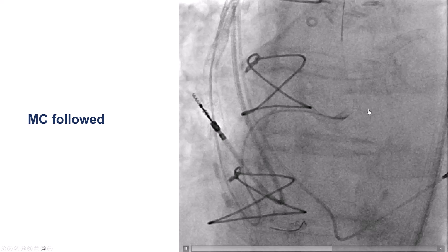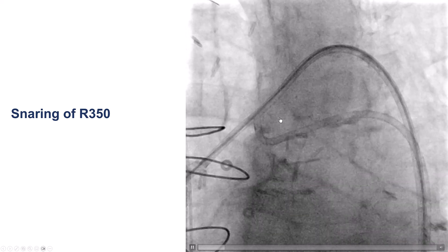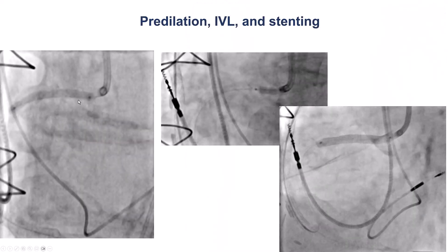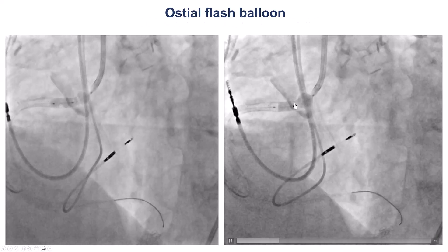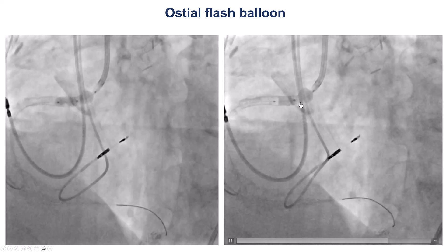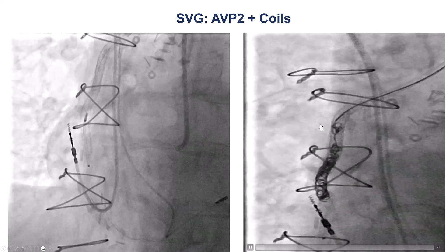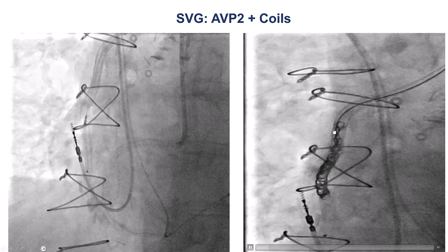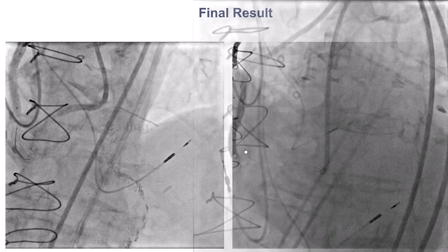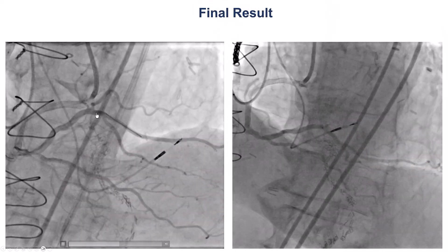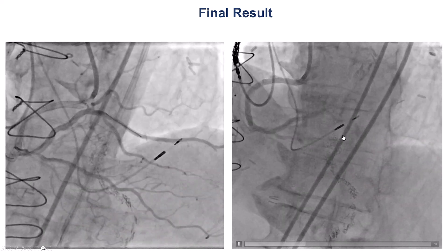We advanced the retrograde Corsair into the aorta, then snared an R350 guide wire. After that, we predilated and stented, using an ostial flash balloon to expand the stent well around the ostium of the right coronary artery. Because there was brisk competitive flow from the saphenous vein graft, we placed coils as well as an Amplatzer Vascular Plug II, which successfully occluded the saphenous vein graft. The final result showed TIMI-3 grade flow from the native right coronary artery all the way to the distal RCA as well as the right posterolateral branch.